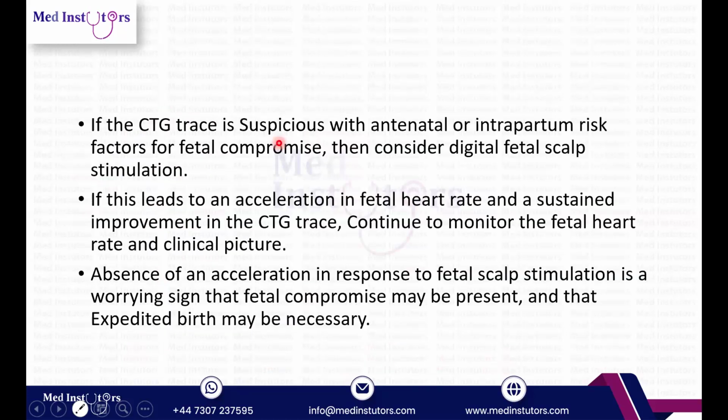And if the CTG trace is suspicious with antenatal or intrapartum risk factors, we can do digital fetal scalp stimulation. Okay. If this leads to an acceleration in fetal heart rate and a sustained improvement in CTG, you can continue to monitor the fetal heart rate. However, absence of an acceleration in response to fetal scalp stimulation is a worrying sign, and that might show that the baby is not doing well, that the fetus is compromised, and we might need to expedite the delivery.